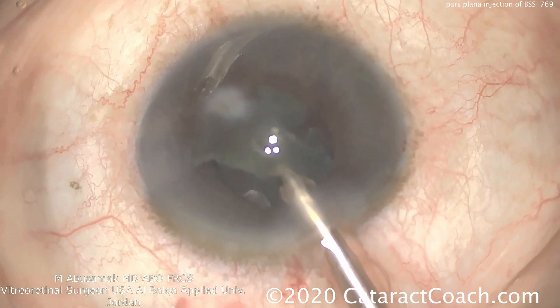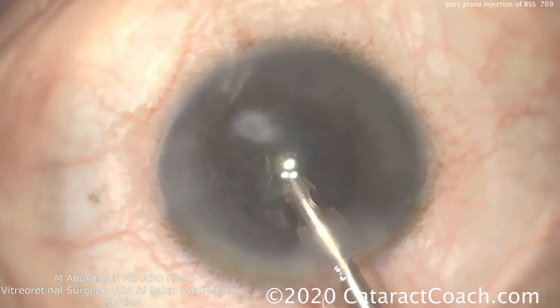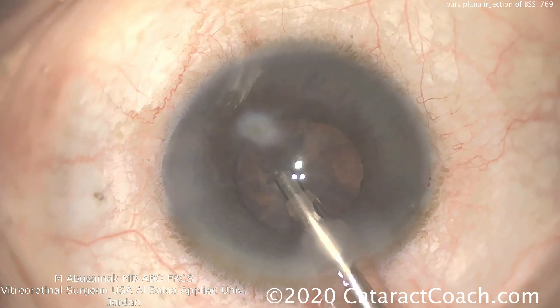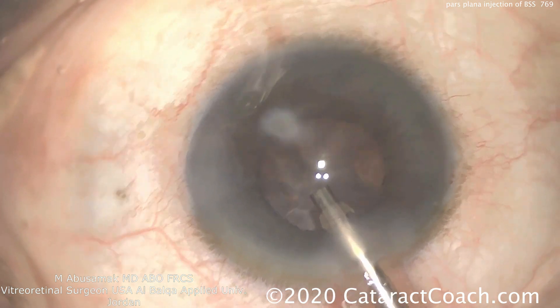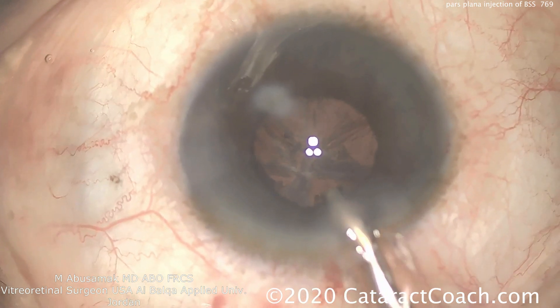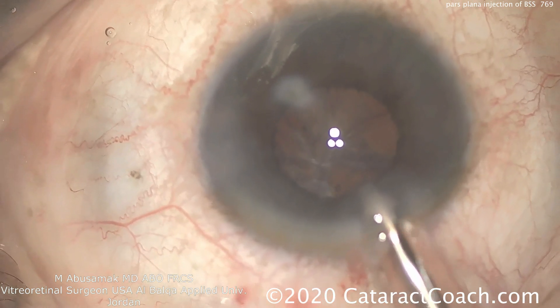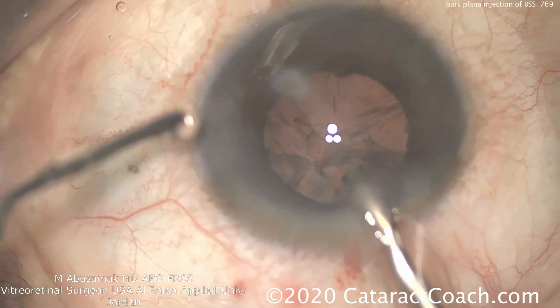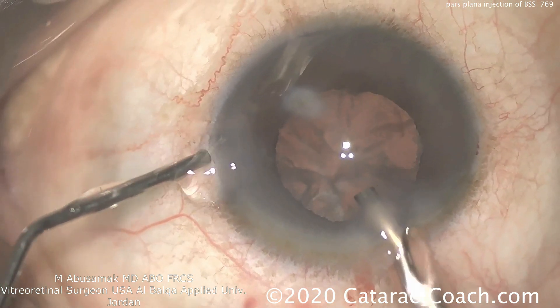Make sure the patient ends up with a little bit of myopia. A patient like this could have a future ability to do an excimer laser ablation of the cornea, and it's more helpful if the patient ends up myopic. When you do your lens calculations, choose the lowest K value in the center of the cornea. That will give you a higher IOL power. Aim for at least a little bit of myopia — minus 1 or minus 2 would be a very reasonable goal.